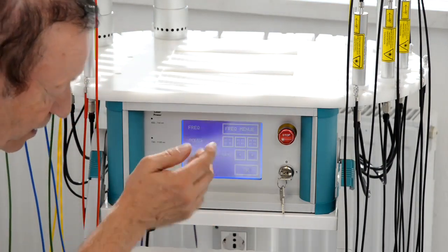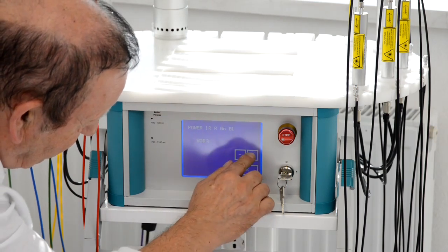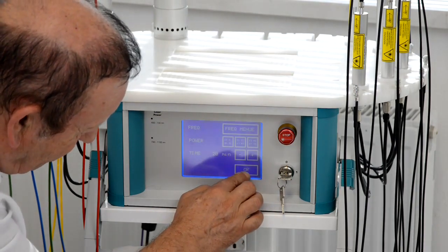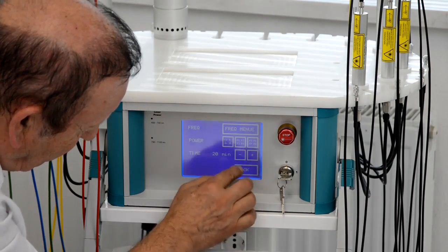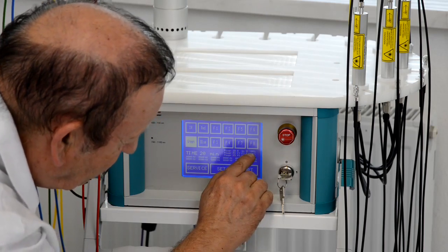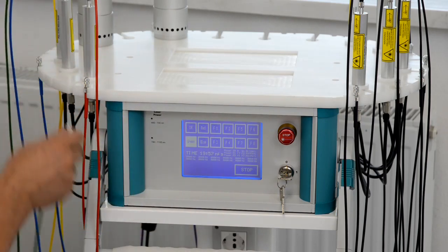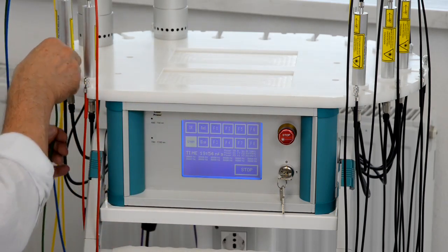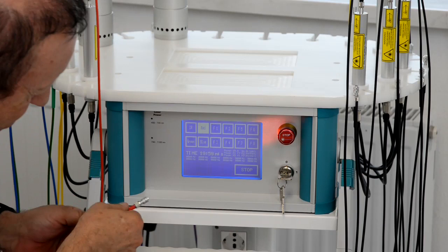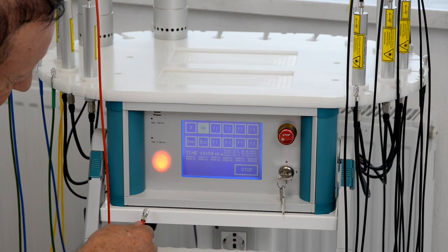So I want to bring the red laser on 100%. I'm on 50%, I'm going up to 100%, I press OK. I check again time and power, OK. And you can see here now for the first group 100%. And I switch my red laser on. Now this is my green laser. You see the power is a lot higher. Let's do it with the red laser. Switch off and on again. You see the light is much stronger than before.